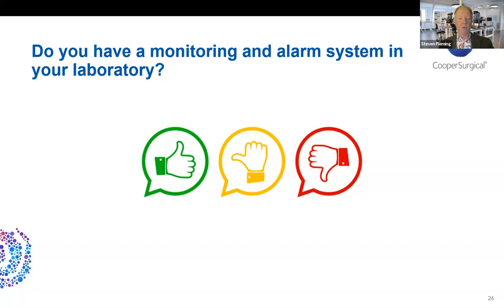Excellent. So three quarters of you do, which is really good. Those that don't, I would suggest you think seriously about it. I've had a liquid nitrogen storage dewar fail. I mean, luckily not one that I had any samples in, but I did learn from that the liquid nitrogen level goes down extremely quickly once the core develops a crack, and the liquid nitrogen can get through the core and evaporates very quickly on the outside of the metal container.